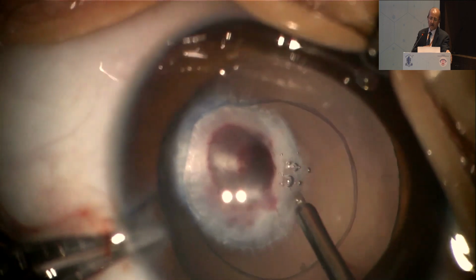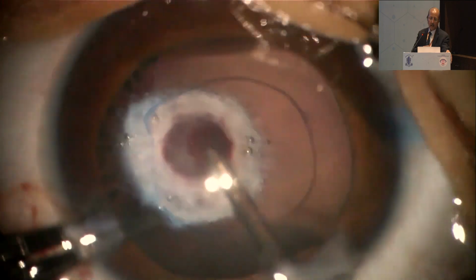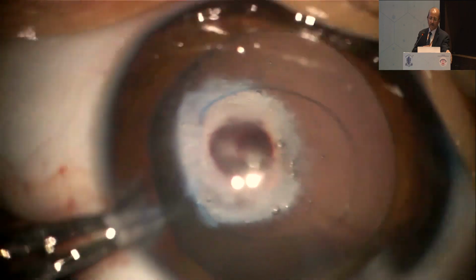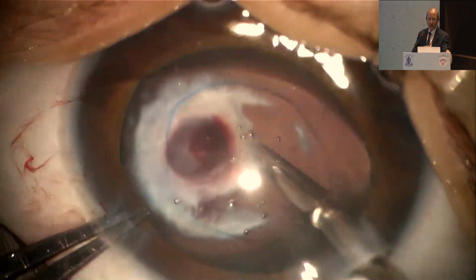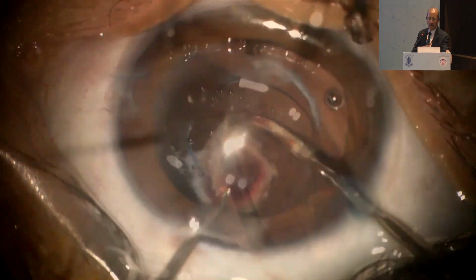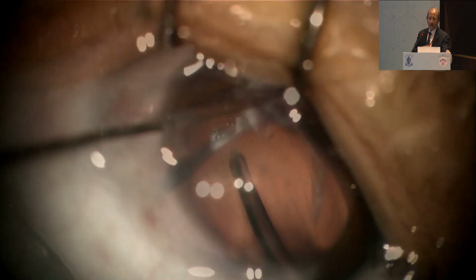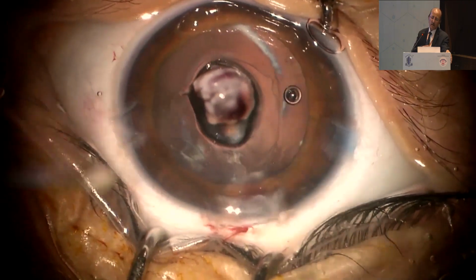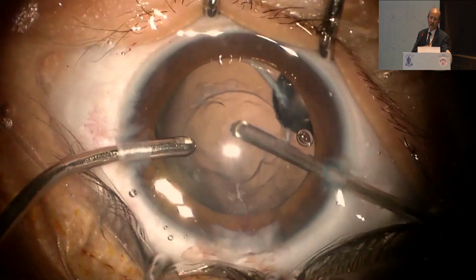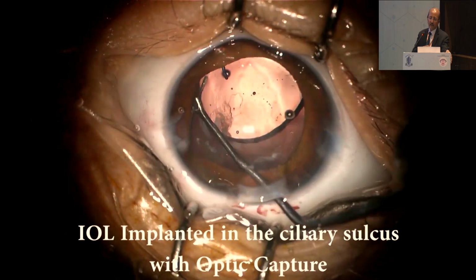Rhexis is made, then cauterization of the vascularized membrane, and then we have to make a capsulotomy and place the IOL. It is difficult to cut with the vitrectomy cutter, but it is quite a thick membrane, and this is cauterization of the stalk, and removal of this stalk so that there is no bleeding after cauterization, and placement of the IOL, because it may be difficult to place the IOL directly into the bag, so the optic is captured into the capsular bag.